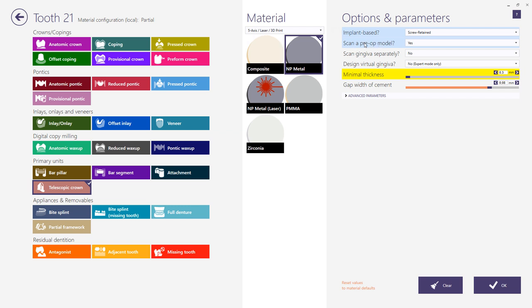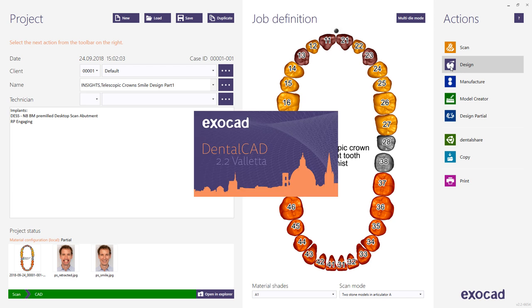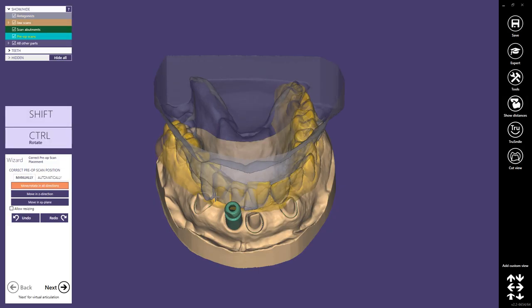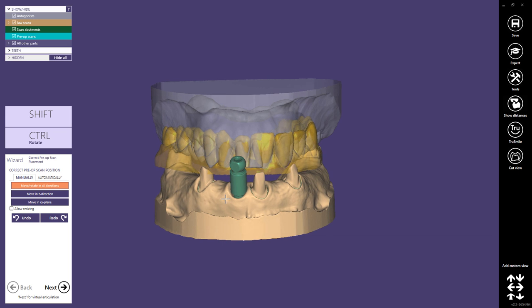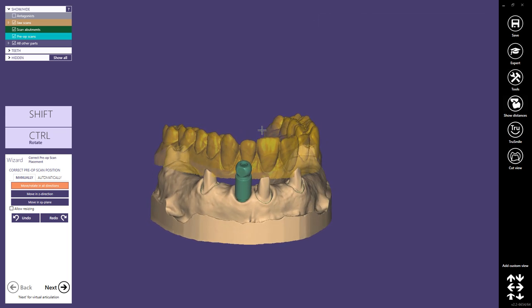We have a pre-op model here. For the other teeth we simply choose telescopic crown with pre-op, no implant, no virtual gingiva. We choose NP-metal as material. In this first step we can correct the pre-op scan position, because usually the pre-op model has been scanned in a second session on a different position in the scanner, and we have to correct the placement.